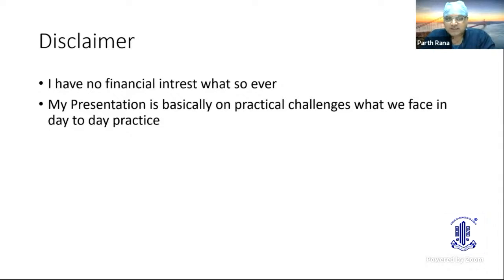My presentation is basically on practical challenges, what we are facing in day-to-day practice. Optos can do so many things, as all of our dignitary presenters have already told us. We can see the retina, we can even see the choroid, we can see blood vessels clearly, we can see through hemorrhage and cataract, we can see even through silicone oil or gas. So this Optos Daytona, which we are using here, is an exceptional instrument. In future, they are going to incorporate OCT. Already they have incorporated OCT in that, which is going to come to India in, I think, a few months or a year. So that also it will be able to do.